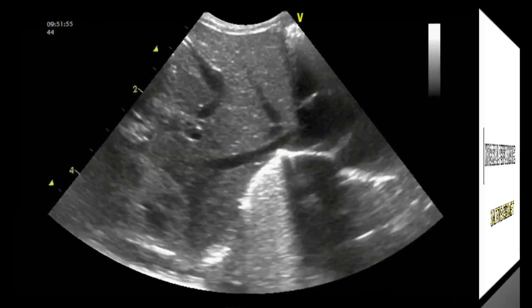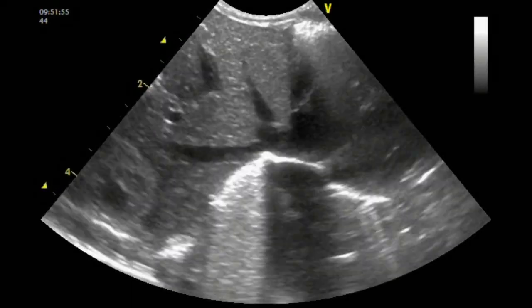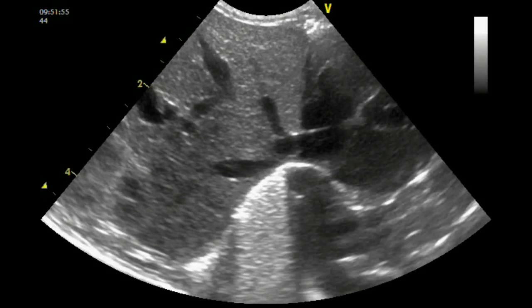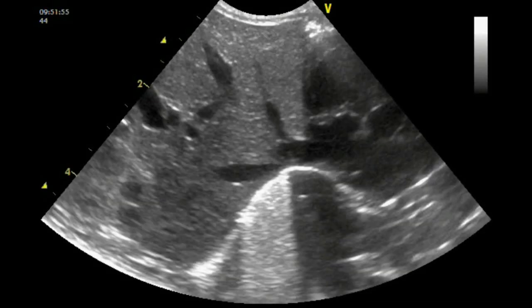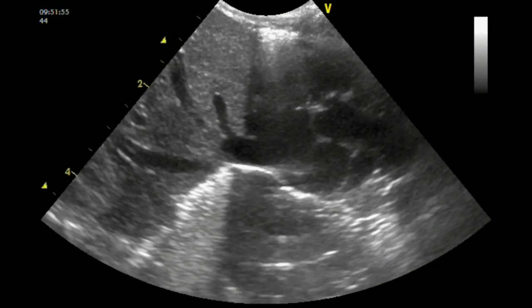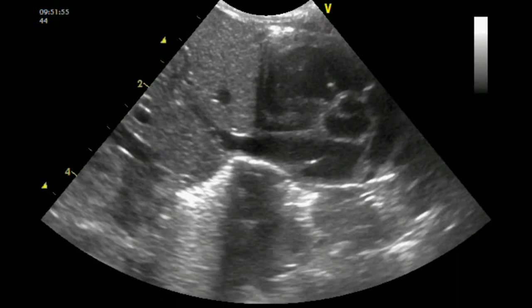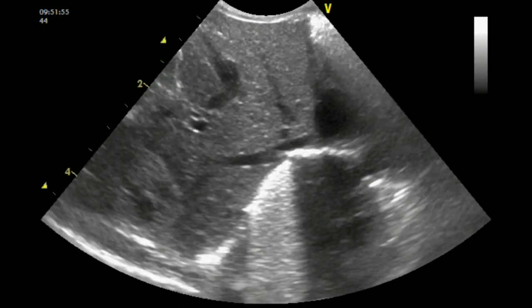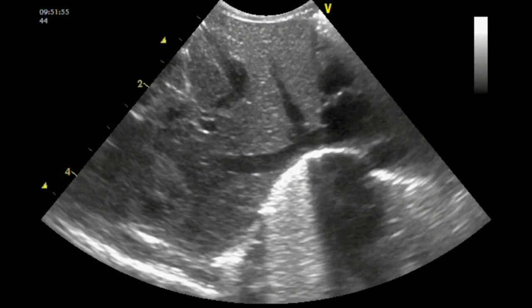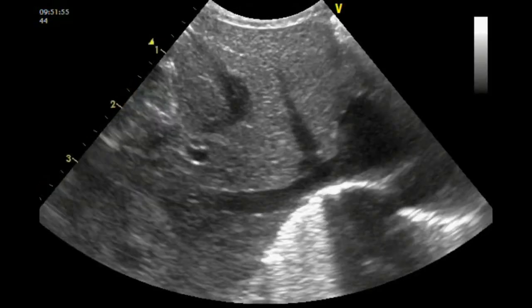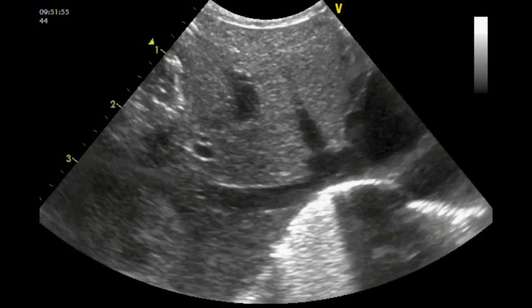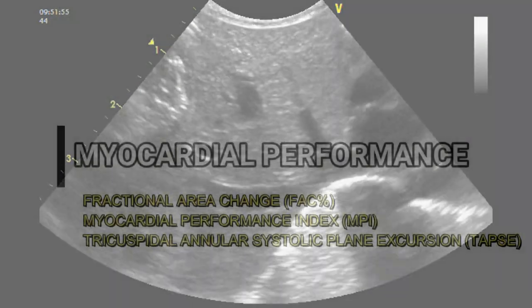At a qualitative assessment, increased pulmonary vascular resistance can cause an increased pulmonary artery diameter. Impaired right ventricular systolic and diastolic performance will lead to dilation of the right ventricle, right atrium, and inferior vena cava.